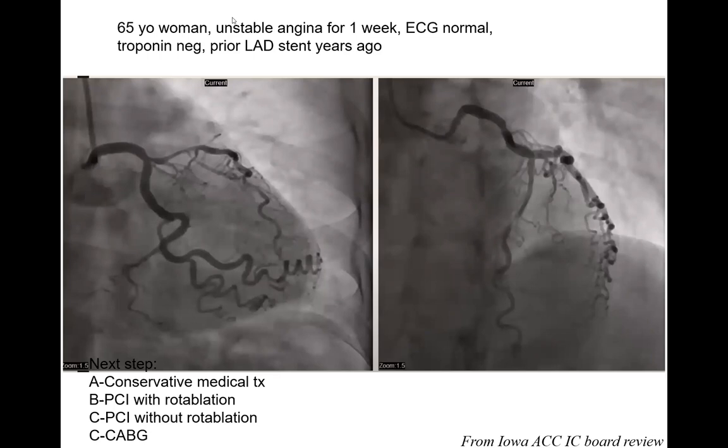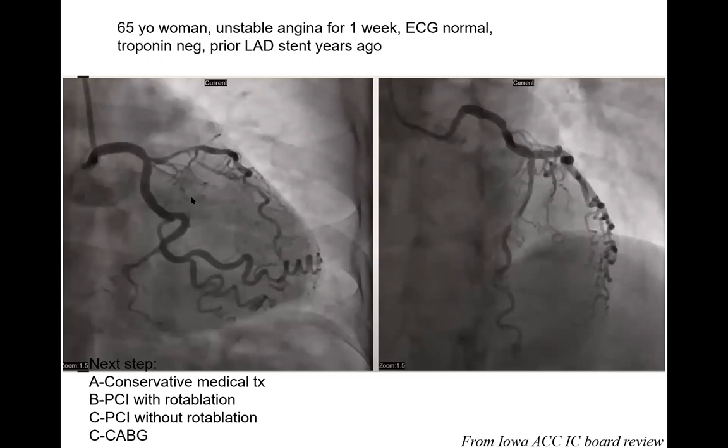This is SCAD — spontaneous coronary artery dissection. The features: typically women (95%), middle age. It looks like a long refractory vasospasm over 30 mm. Very tortuous artery — extreme tortuosity and corkscrew arteries in the LAD and circumflex, dissecting at the edges of those tortuosities. Very classic for SCAD. There are two main types: one with a visible false and true lumen, and more commonly (70%), intramural hematoma where the wall bleeds from inside without intimal tear, causing diffuse narrowing.